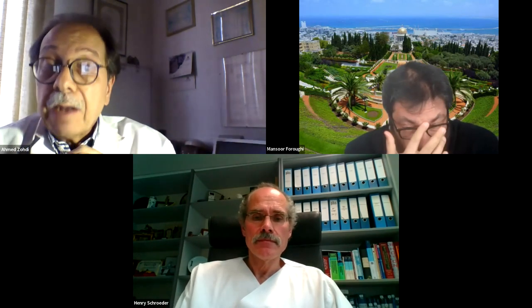When you go in with the endoscope, acute hydrocephalus with a posterior fossa tumor is not like congenital hydrocephalus or a chronic kind of hydrocephalus, with all the structures stretched out, displaced, and so on. So you have to be ready. And as I stated in one of my slides, from port to exit you are facing different kinds of anatomies, starting from the foramen of Monroe, starting from the veins going into the foramen of Monroe. They are not constant. Everything is not constant: the amount of choroid plexus, the inclination of the foramen of Monroe. This is the prime thing to learn.